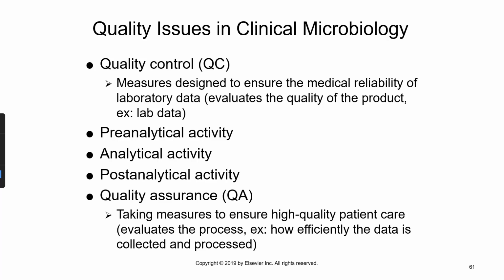Now, that doesn't escape healthcare. In healthcare, everyone's got choices of where they want to go. If we have a microbiology lab that's continuously misdiagnosing, then people are not going to want to return to that lab or that healthcare facility, or their confidence in that facility is going to decline. So when we talk about quality, we're mostly referring to the validity of the results that are released from the lab, whether the lab was able to diagnose the infection properly or not.